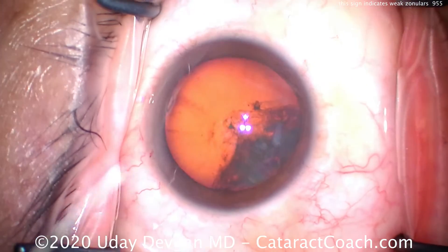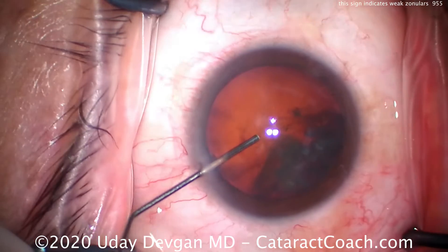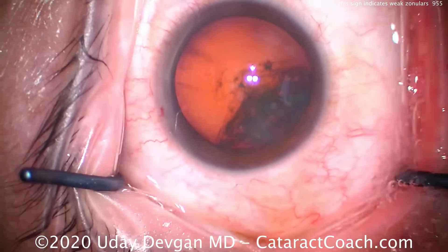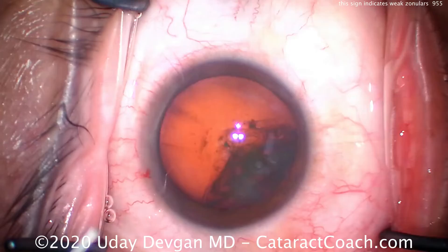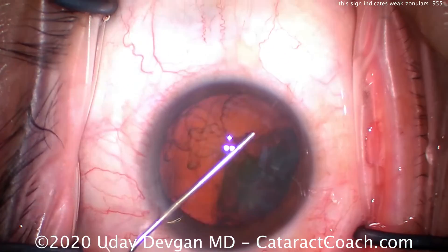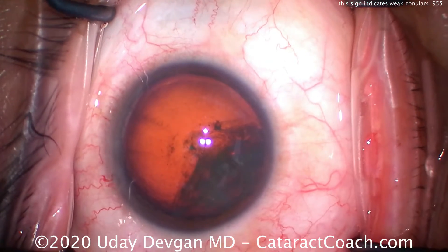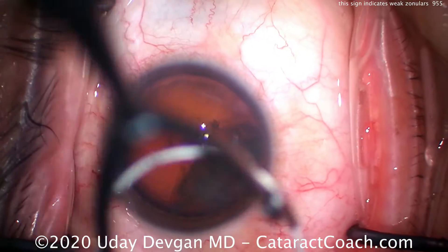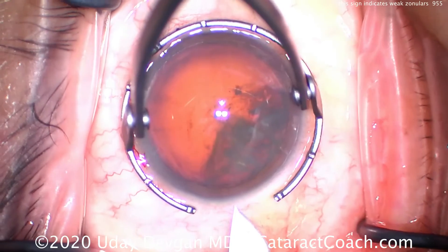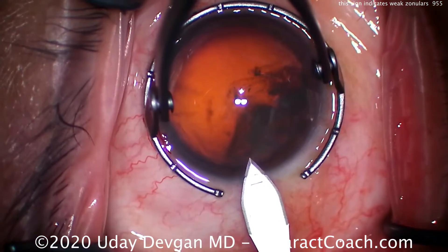At the pre-op exam everything looked normal. We're filling the anterior chamber here with our anesthetic — this is preservative-free lidocaine cut 50/50 with balanced salt solution. Now here's an important part: we're filling the anterior chamber with the dispersive viscoelastic, and we get that wave that creates a cast, essentially filling the AC completely. So the volume of viscoelastic is the same as the volume of the whole anterior chamber.